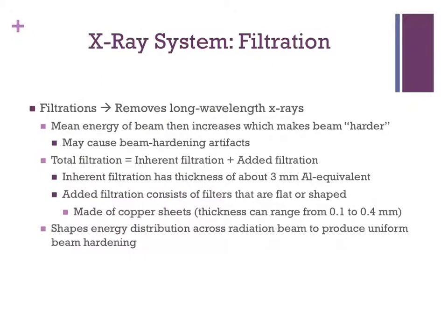Radiation from X-ray tubes consists of long and short wavelengths. The beam is polychromatic, which means it has a broad spectrum of X-ray energies. However, it is very important that the polychromatic beam has the appearance of a monochromatic beam to satisfy the requirements of the reconstruction process, so a special filter must be used.